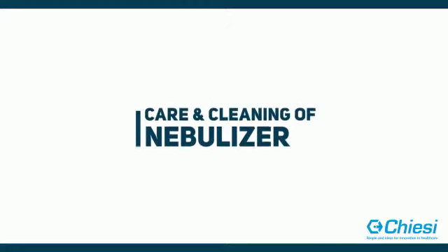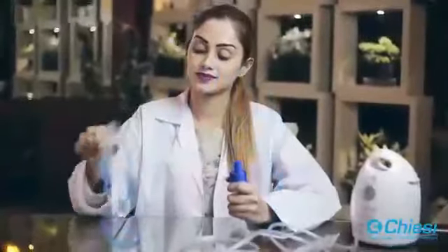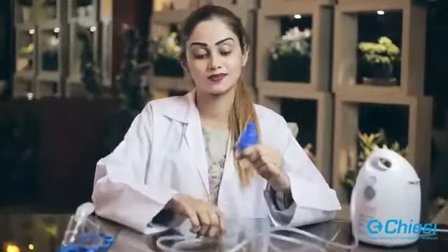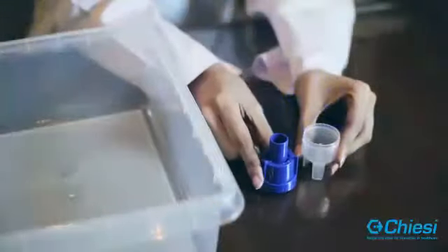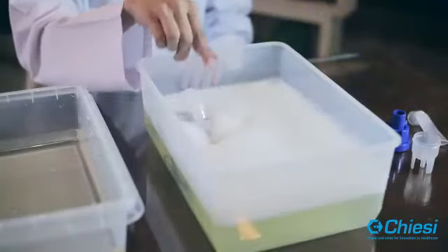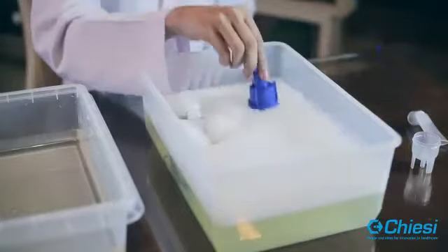Care and cleaning of nebulizer. Take apart the nebulizer. If medicine remains in the medicine chamber, drain it. Wash all parts except tubing in liquid soap and water.